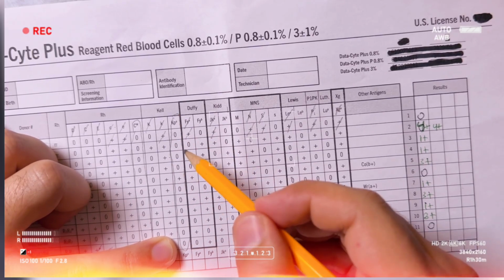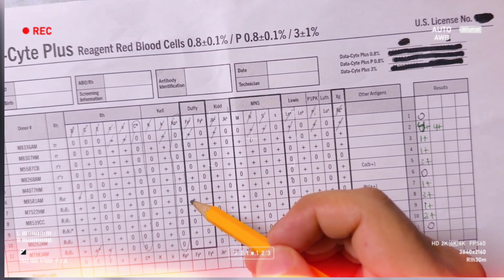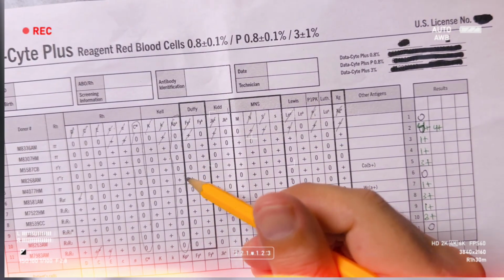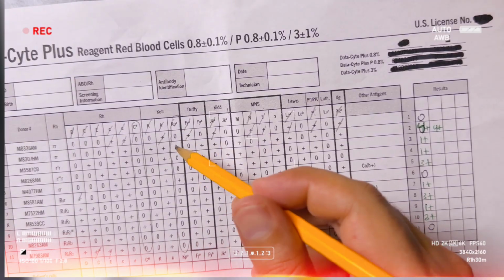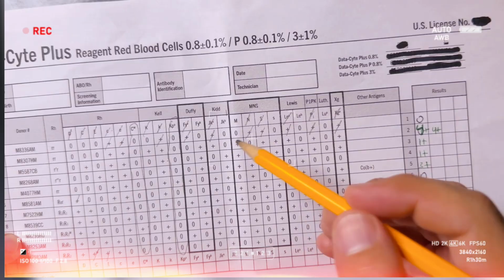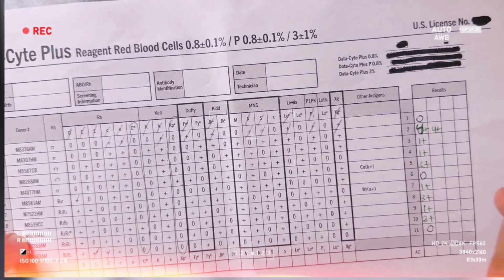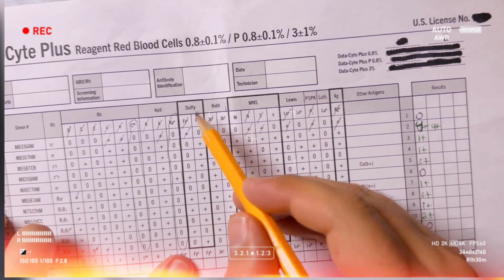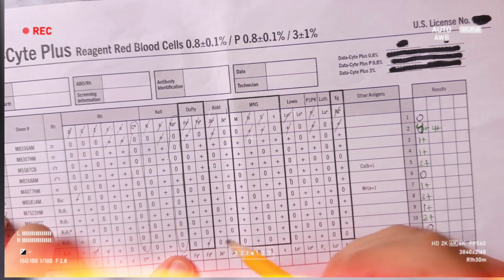If you don't have a reaction in more than 2 or 3 cells, you can leave that. It's not clinically significant. Your focus is only on clinically significant antibodies, which have more than 2 or 3 reactions. So FYB we can rule out here on the 11 panel.